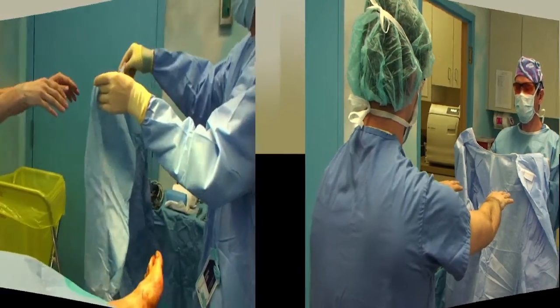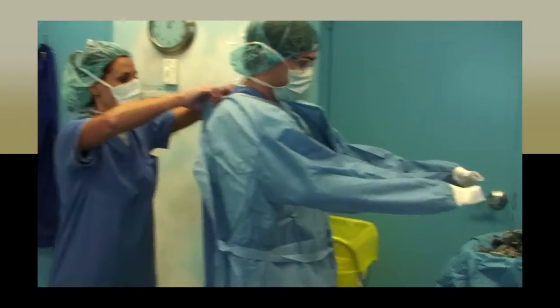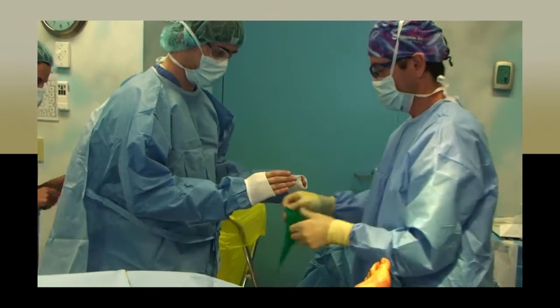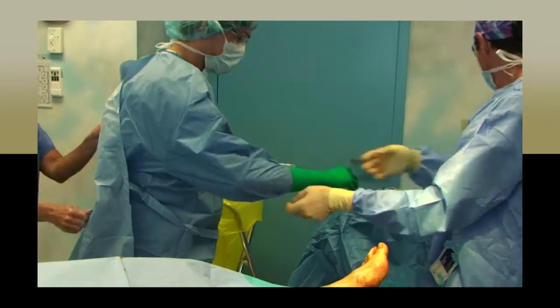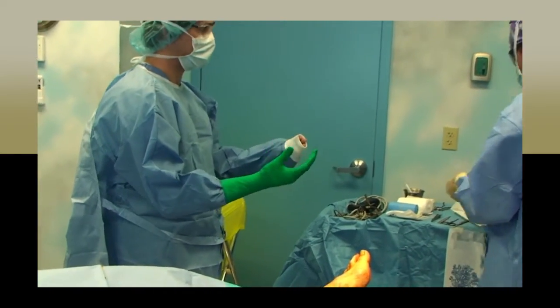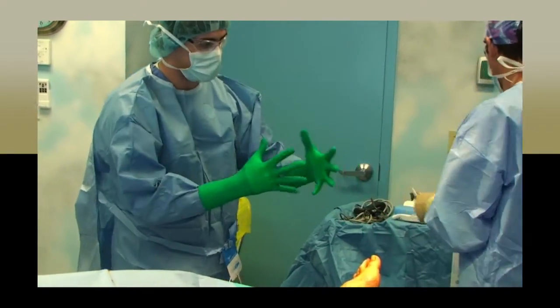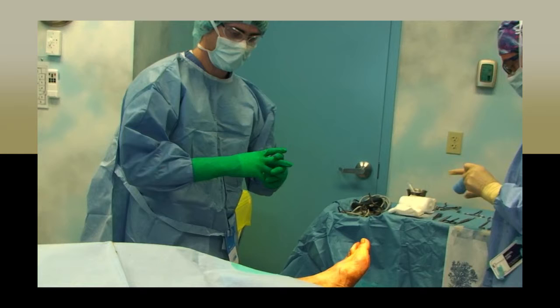The surgeon will then place his or her hands in the flap at the arms, and you will help them slide the gown on. You will then open his set of gloves and take a glove, unrolling the cuff, and with both hands you will widely open the opening of the gloves, with the thumb of the glove toward the surgeon. The surgeon will slide his fingers to the edge of the cuff of the gown, or you can help them pull his gown sleeve down as he holds his hands out and up, and he will then place his hand in the glove at the same time as you pull up over his gown sleeve. It is customary to begin with the right hand when gloving. When the surgeon is gowned and gloved, you will help him or her finish the tie the way instructed above.